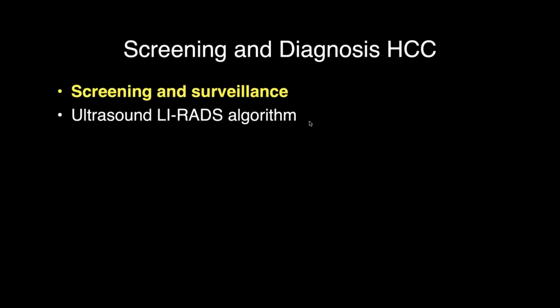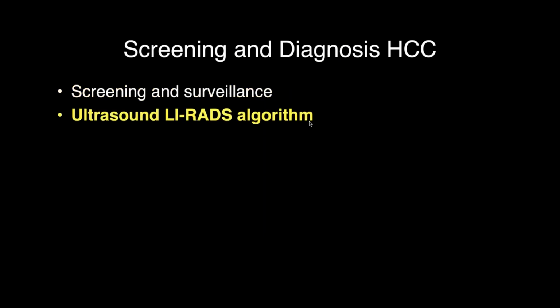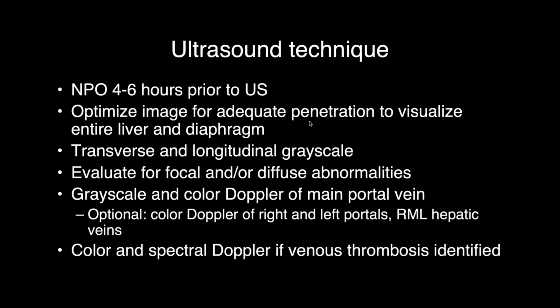Okay, so that's a little bit of background about screening and surveillance. Let's move on to the ultrasound LI-RADS algorithm. In our ultrasound LI-RADS core, we provide some guidance as to how to perform the examination.